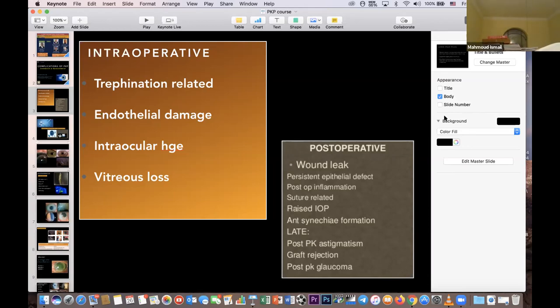There is another trick to perform cataract surgery with good visualization when you are combining it with a graft. You make a partial trephination and remove a lot of layers of the cornea, at least two thirds of the cornea. Then you will encounter clear media, so at least you can do the capsulorhexis. If you do the capsulorhexis, at least you have safe removal of the nucleus without tearing the capsule.